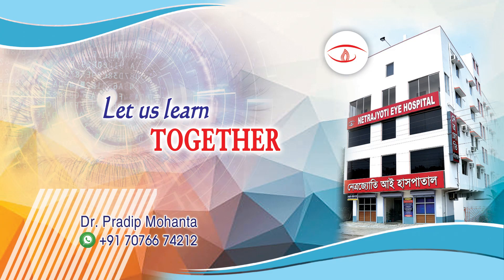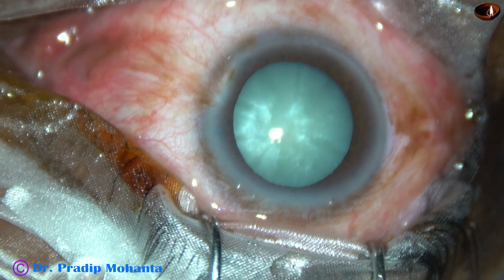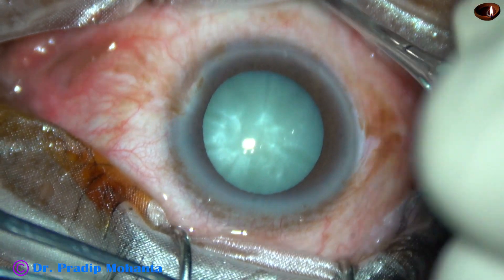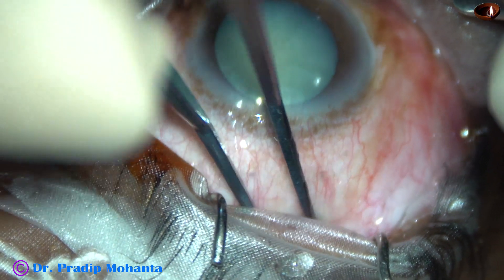Friends, welcome to my workplace at Ranaghat, West Bengal, India. This is an intumescent cataract, operated due to economic reasons. We have planned SICS, that is Small Incision Cataract Surgery in this case. Let us observe this surgery.